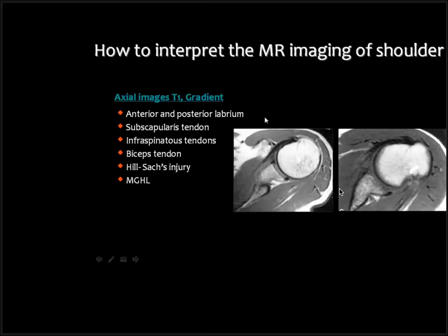On axial sections, we can see the subscapularis muscle, tendon, and insertion; and the infraspinatus muscle, tendon, and insertion. We can see the biceps in between, and the transverse humeral ligament above. We can see the anterior and posterior labrum. In the anterior labrum, we can see the middle glenohumeral ligament also.